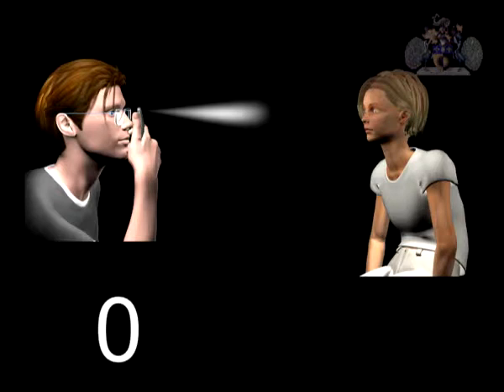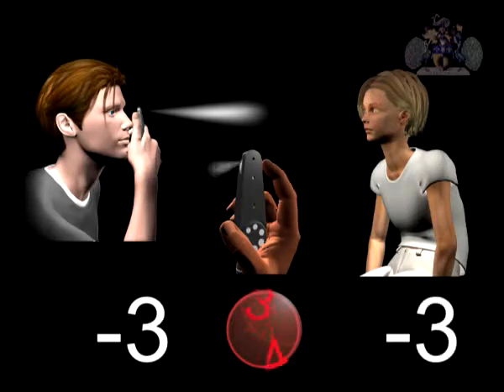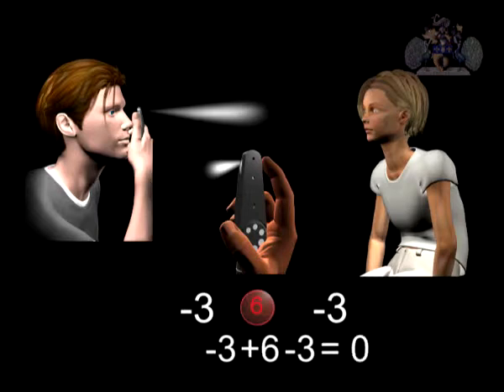If the examiner has a refractive error of -3 and removes his or her distance spectacles, then a red 3 needs to be dialed into the ophthalmoscope. If then the patient's refractive error is also known and also happens to be -3, then a further 3 needs to be factored in. In other words, the red dial needs to read 6. The cumulative refractive error of examiner plus patient must be cancelled out by the appropriate lens in the ophthalmoscope for the system to be in focus.